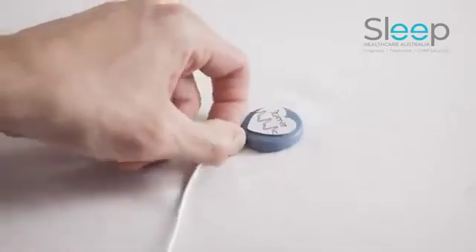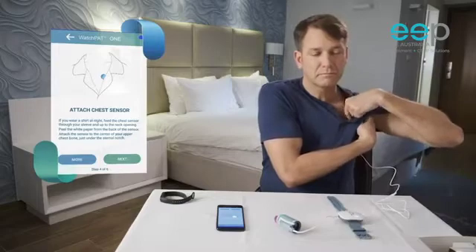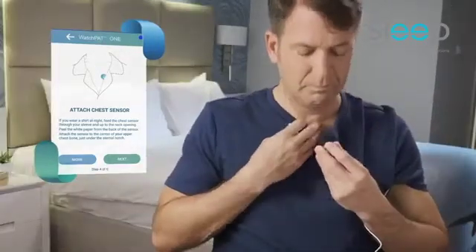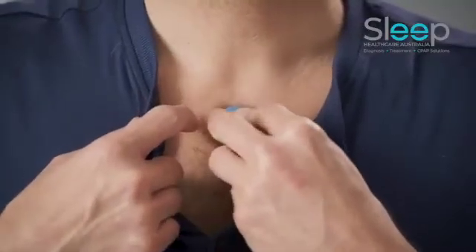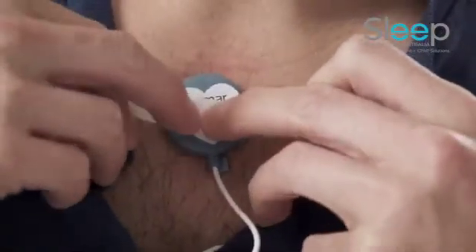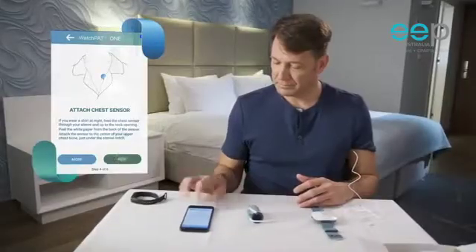Now take the snoring and body position sensor and direct the sensor cable through your pajamas sleeve up to your neck opening. Remove the tab from the sticker and attach the sensor just below your sternal notch. It is recommended to use medical tape to secure the sensor in place. Press next.